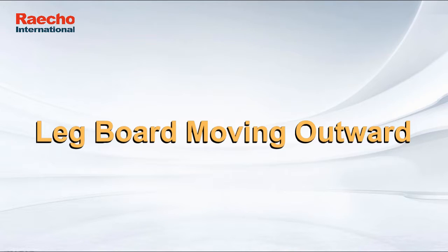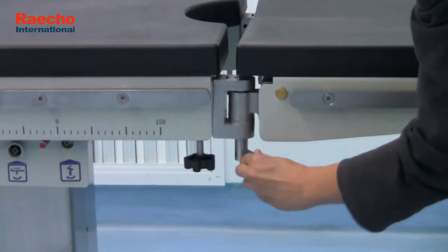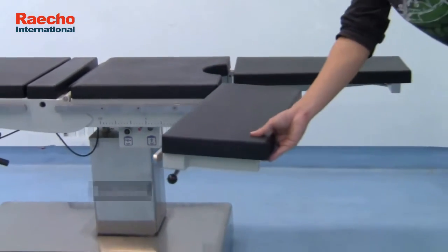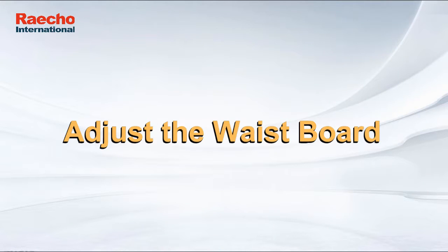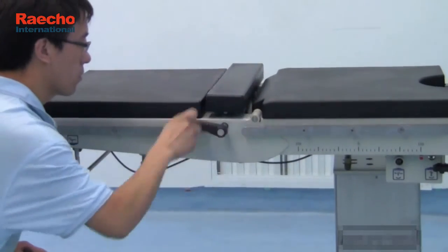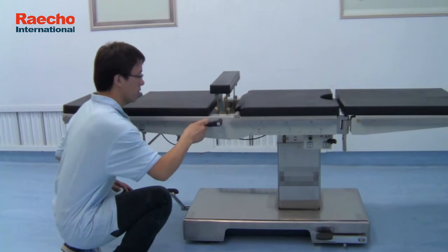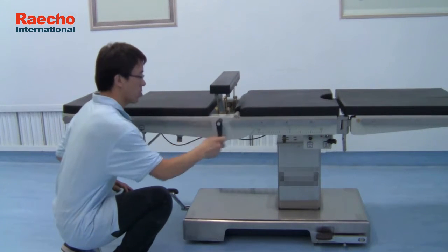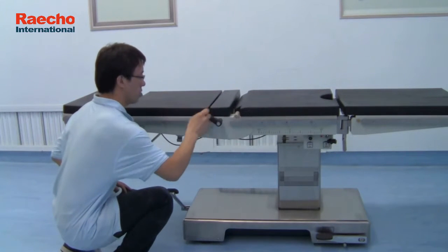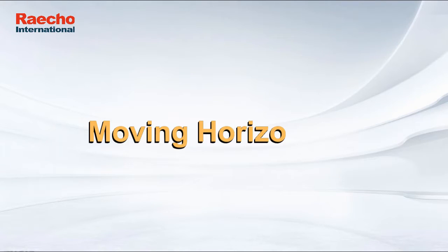Legboard Moving Outward. Adjust the waist board. Moving horizontally.